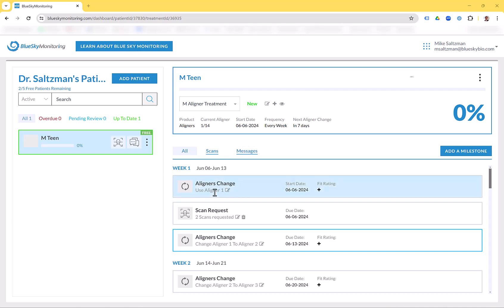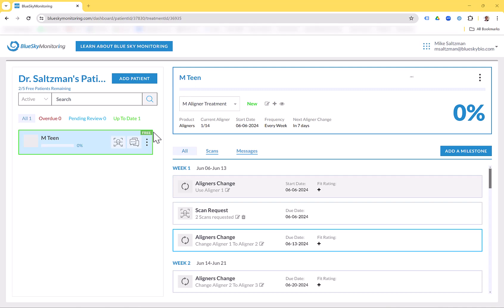All the settings and data on the screen can be modified if needed. For example, if the start date is a week later, click the pencil, edit the relevant information, and everything will update accordingly. Every user gets their first five patients free when they start using Blue Sky Monitoring. In addition, all patients for whom you order Pronto Aligners for manufacturing — when the patient data is imported into Blue Sky Monitoring — that patient will also automatically be free. So you can have an endless number of free Blue Sky Monitoring patients every time you order Pronto Aligners.